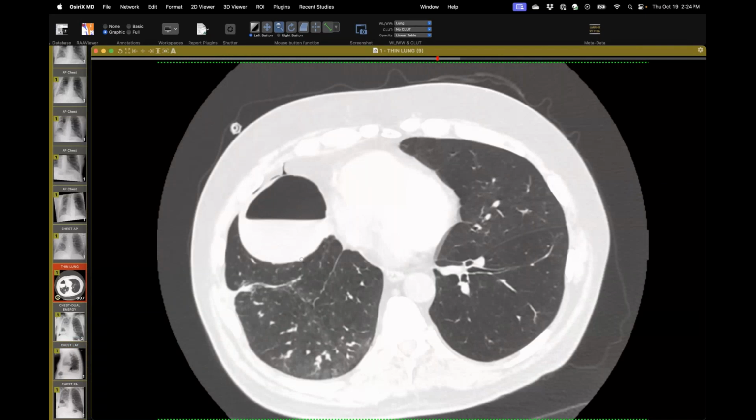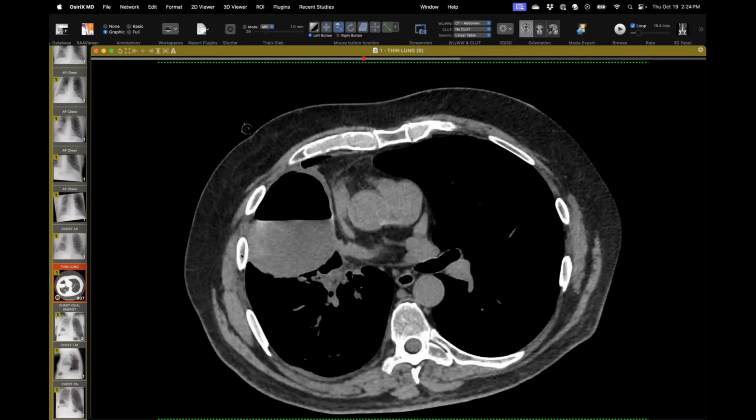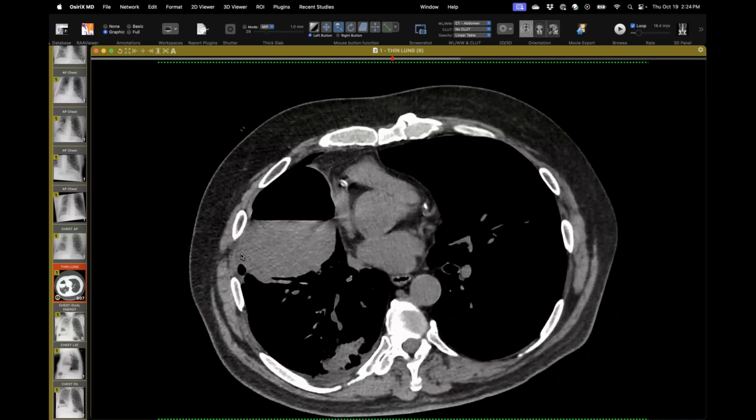Before they placed the valves, there wasn't a CT showing a big bulla in this location before? There's no bulla. Yeah, we always do a planning CT, but that's one of the contraindications sometimes. If there is a big bulla, they won't put a valve in that lobe. But yeah, one of these weird ones here.